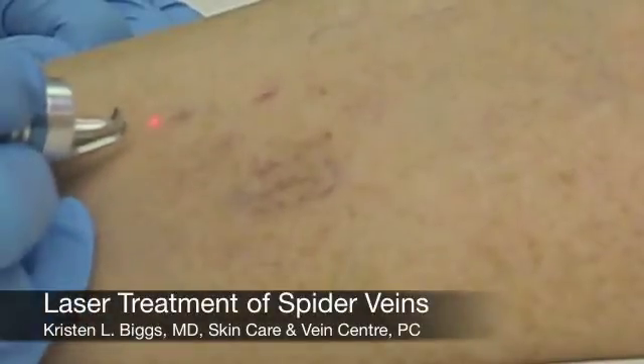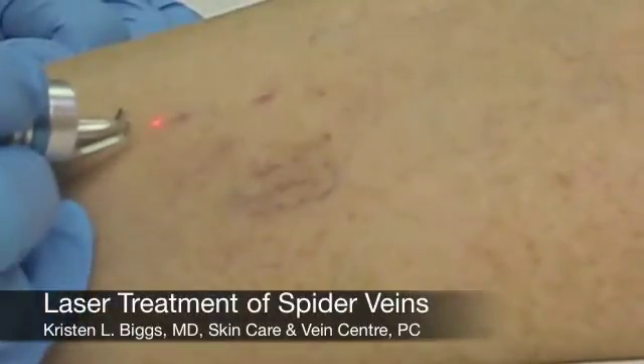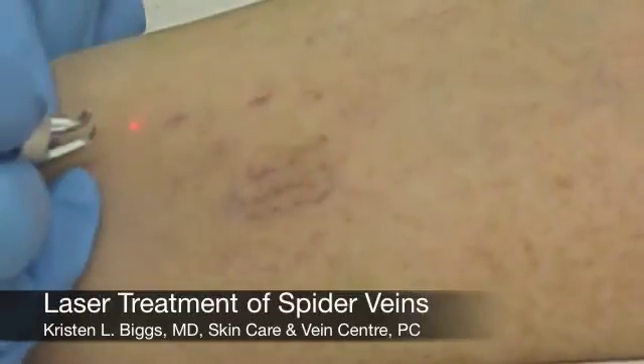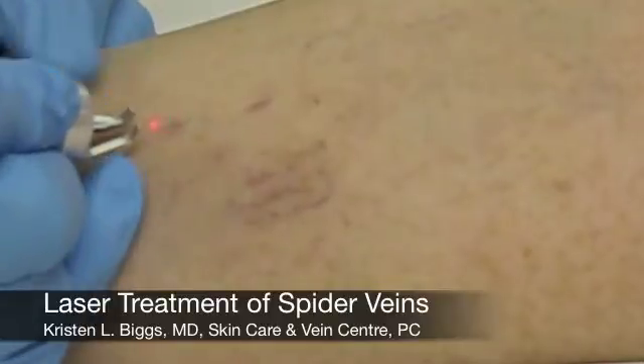Today we're going to be using the Dornier vascular laser to treat some of these spider veins on our patient's leg that you can see here. I'm going to show you just how quick and easy this is.